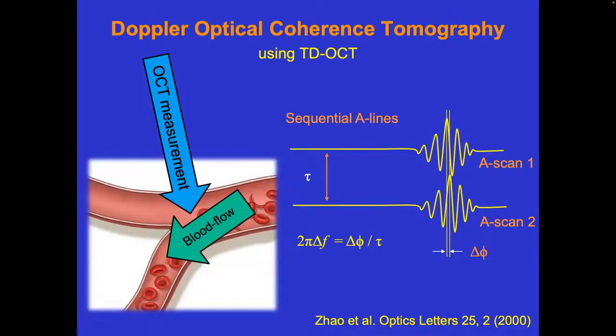You mean here? Yeah, because on this slide, I was actually thinking, wait, the blood flow is moving at an orthogonal angle, as in not parallel. So how would you get the phase to change, barring Doppler effects?